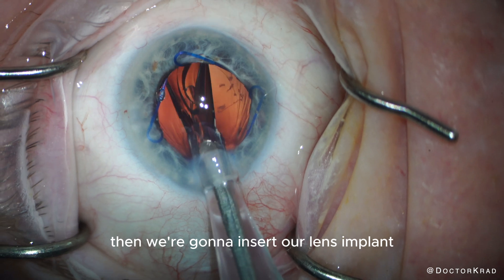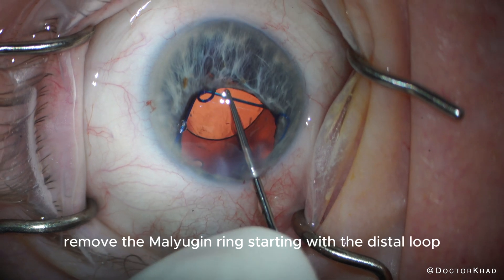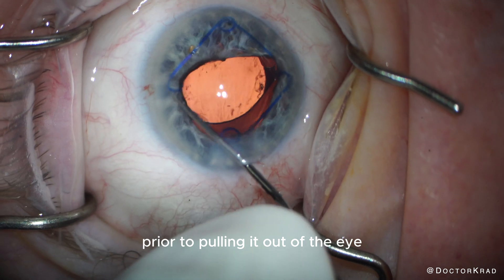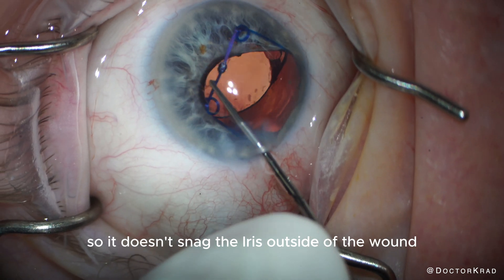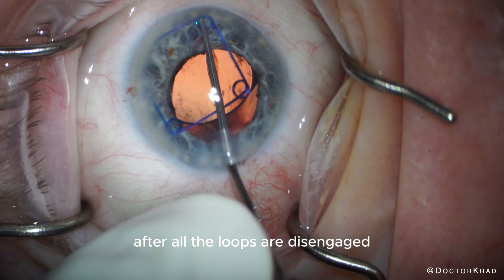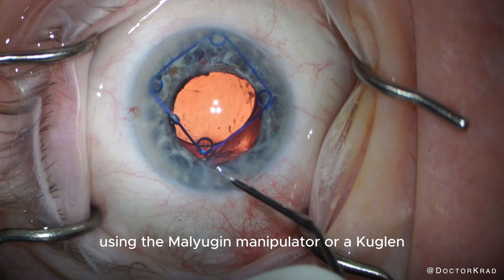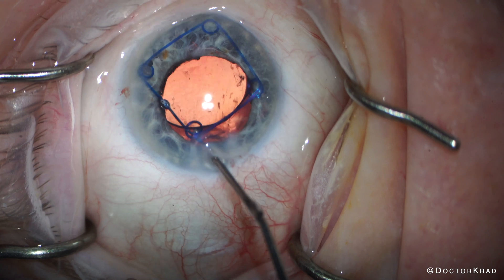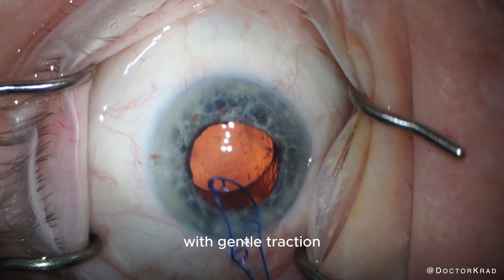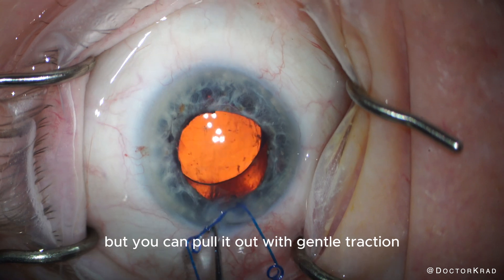Then we're going to insert our lens implant. Remove the Malyugin ring starting with the distal loop. Always disengage the loops prior to pulling it out of the eye so it doesn't snag the iris outside of the wound. After all the loops are disengaged, you can remove the Malyugin ring using the Malyugin manipulator or a Kuglin. The first three loops usually come out easily with gentle traction; the final loop is usually a little more stubborn, but you can pull it out with gentle traction or just burp it out.